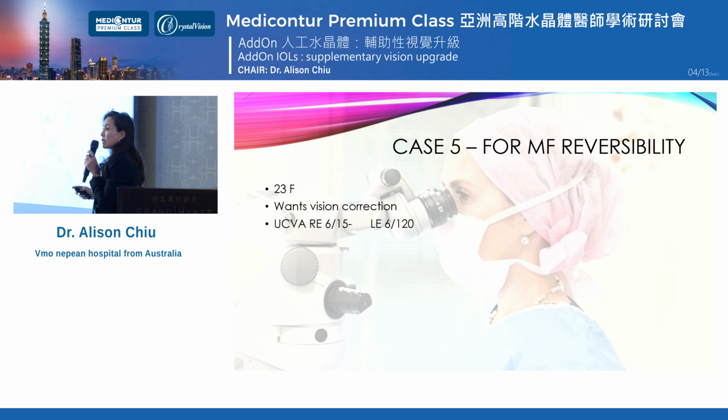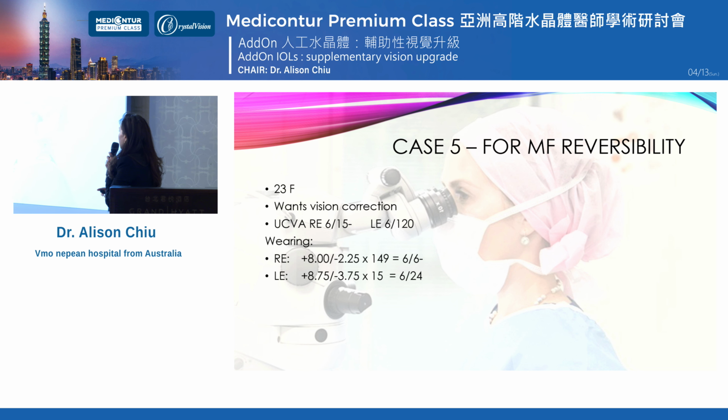So this is a 23-year-old woman, very young, and she's got an element of left amblyopia, and her best corrected vision with her high hyperopic script, so +8, is 6/6 and 6/24. She was not suitable for laser vision correction with this kind of hyperopic script.